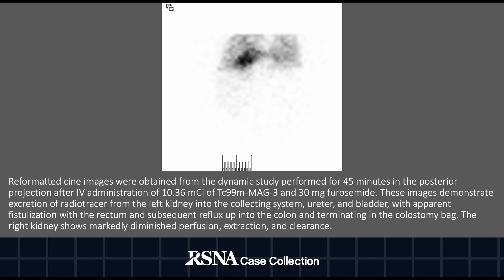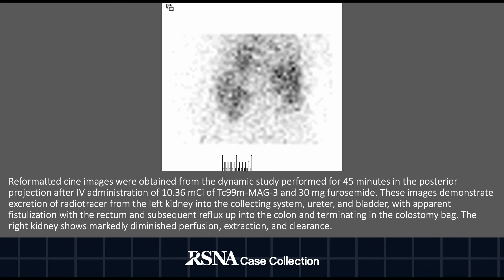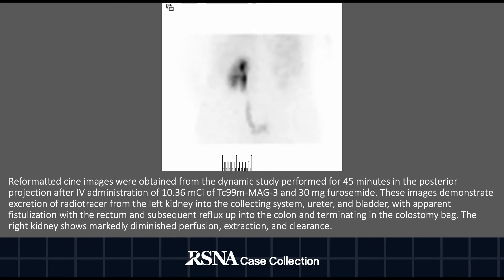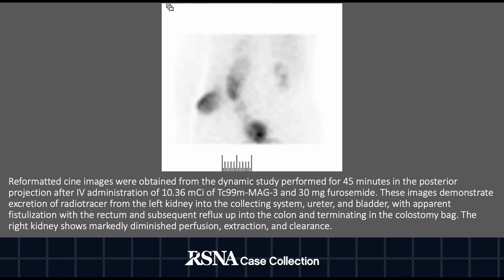Dynamic images were obtained after the administration of technetium MAG-3 and 30 milligrams of furosemide. These images demonstrate excretion of radiotracer from the left kidney into the collecting system, into the ureter and bladder, with apparent visualization with the rectum and subsequent reflux up into the colon which terminates in the colostomy bag.